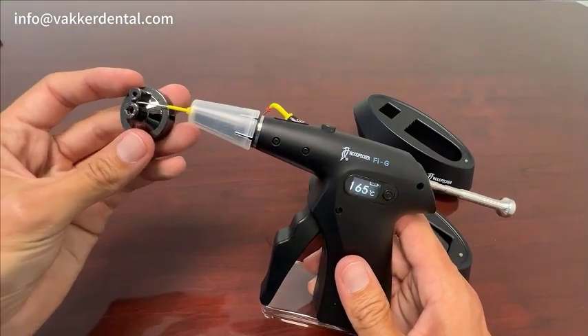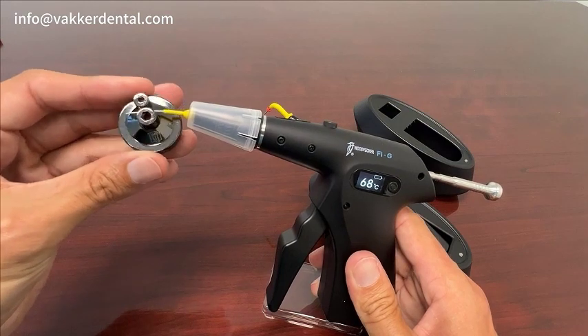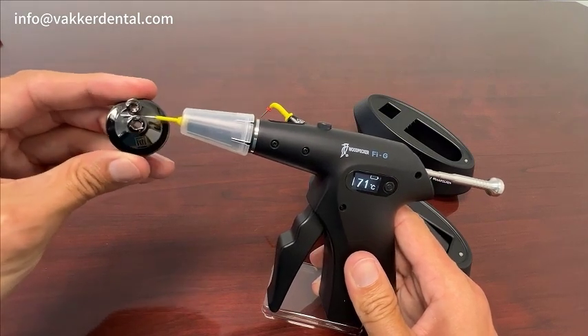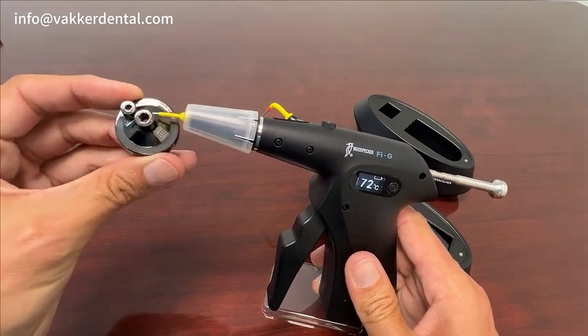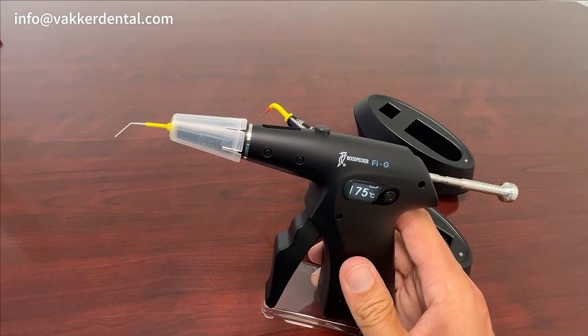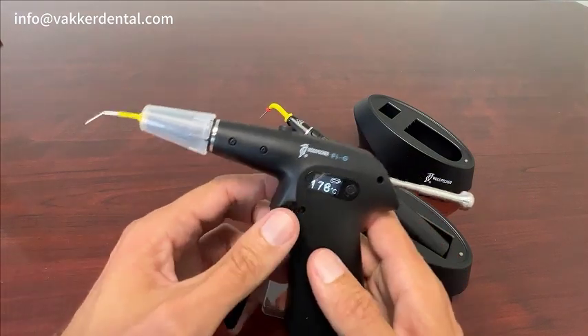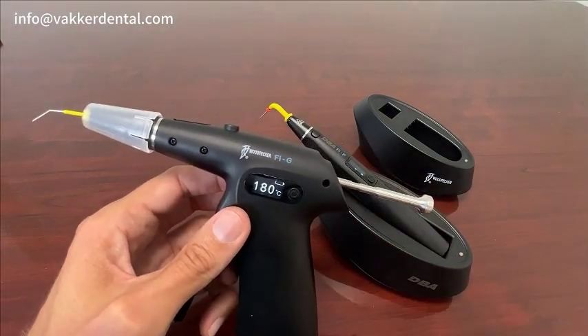With this tip, you can also bend it. Slide it in between the two prongs on the tool and then bend it by just curving it — now you have a curved tip. These tips come in a four-pack, and there are different sizes and gauges available as well.